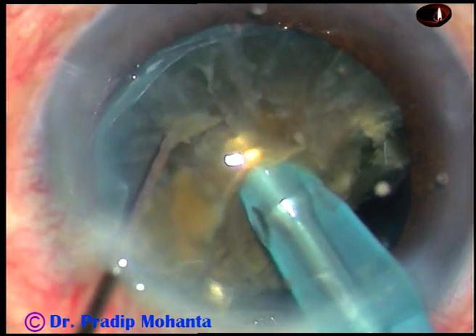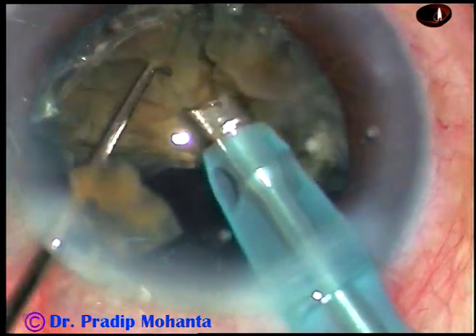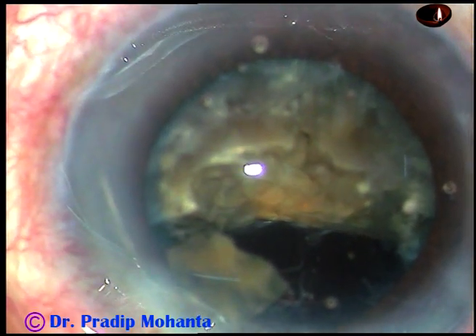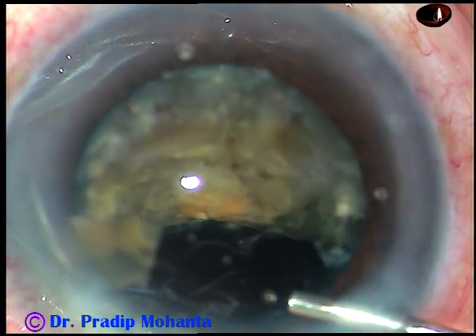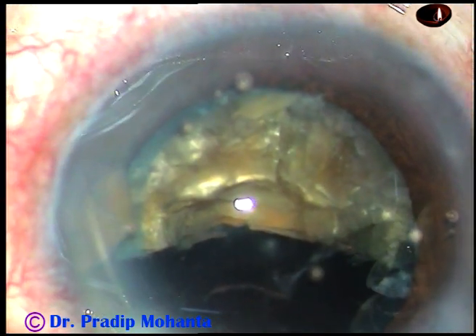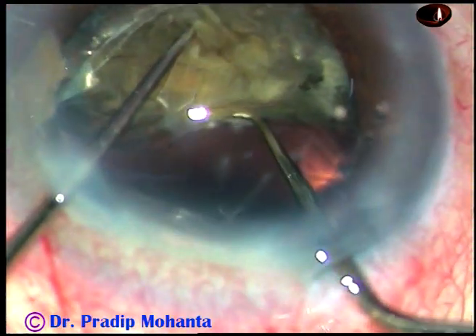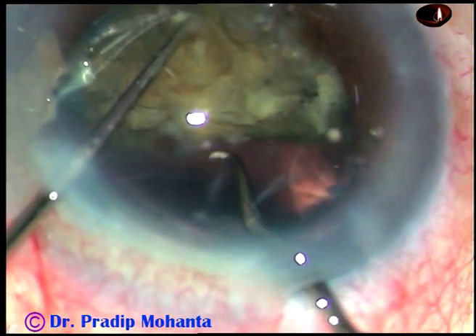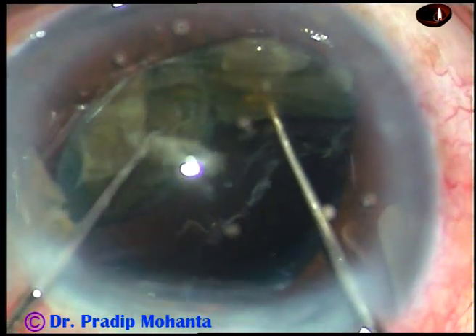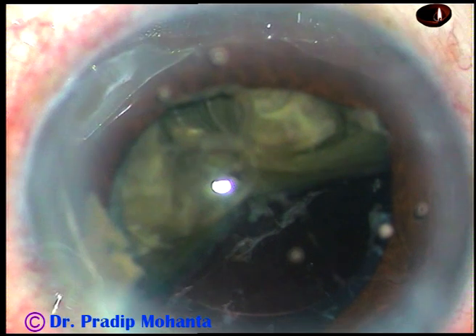Now I have come to the other hemi-nucleus and am dividing it into two pieces. I find the pieces are still not completely separate, so I inject more viscoelastic substance, take the Sinnsky hook and chopper again — Sinnsky hook in my right hand, chopper in my left hand — go behind the piece, and with the help of these two hooks I could separate the hemi-nucleus into two pieces.